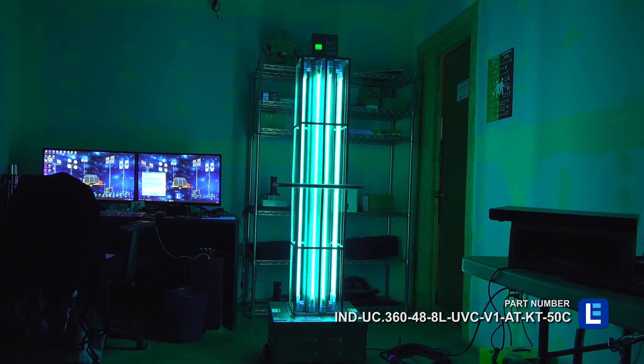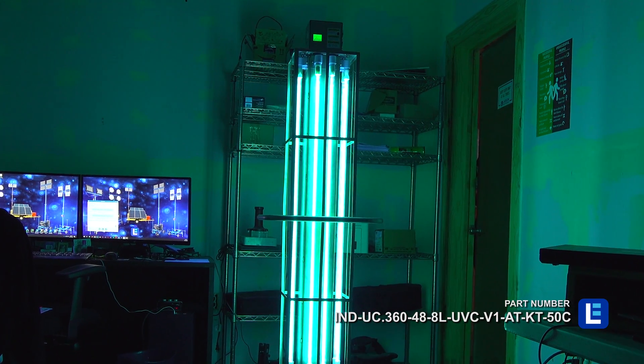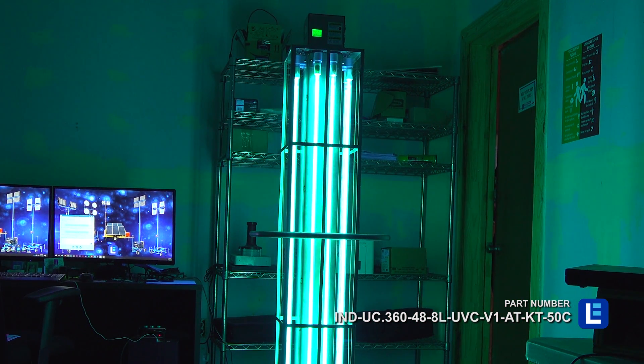The lights have an expected lifespan of 8,000 plus hours and they emit a flood beam pattern. This UV system caters to 3,500 square feet of space with full 360 degrees of coverage.